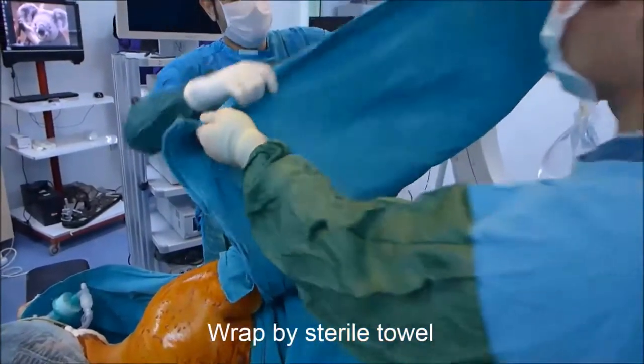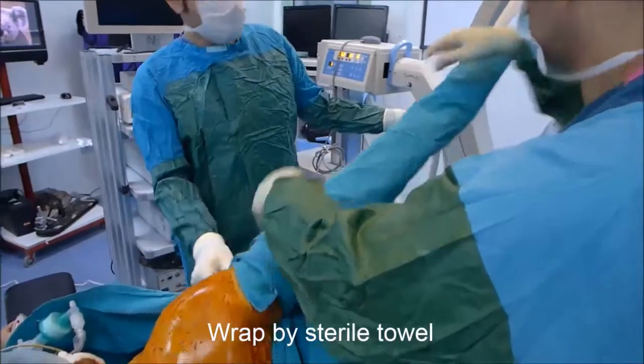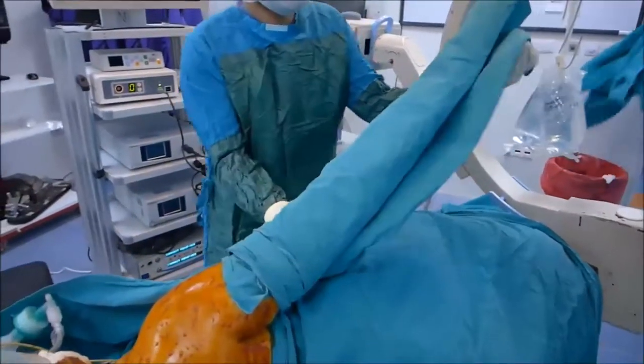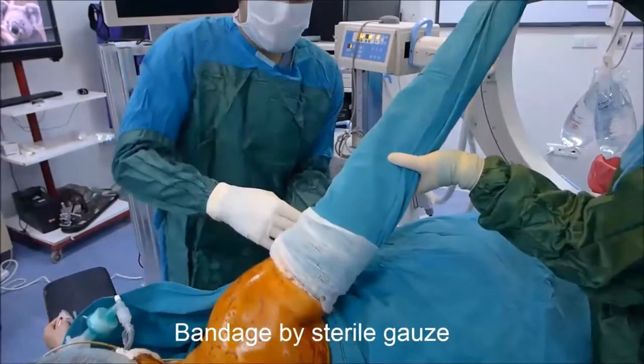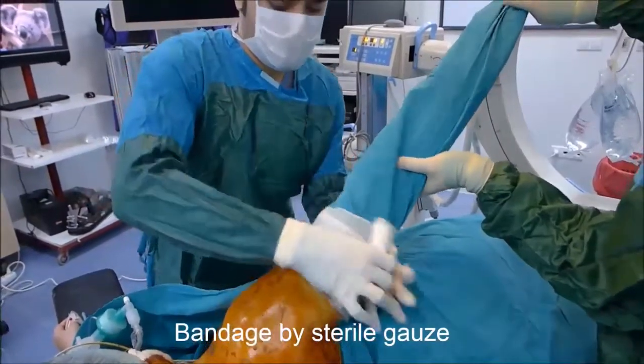After preparation of the skin and initial draping, the skin traction is wrapped by a multi-layer sterile towel. Then the sterile towel is bandaged by a couple of sterile gauze bandages.